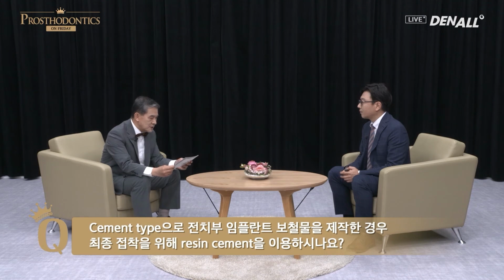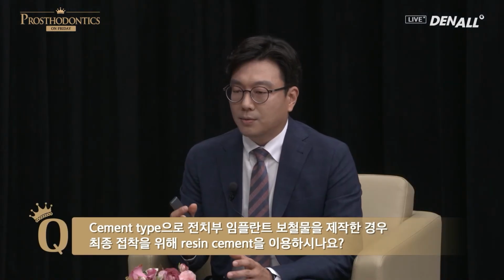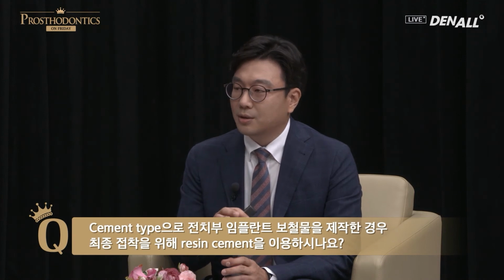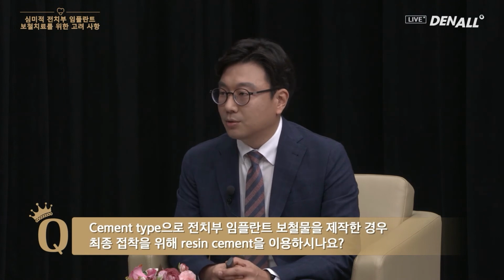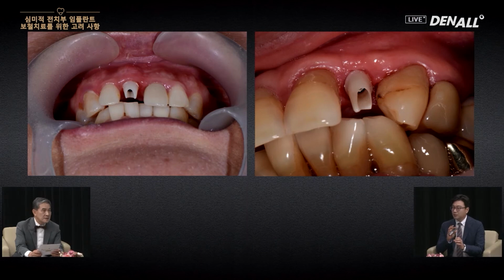Do you use the resin cement for the final cementation? In my case, for the final cementation in the anterior region, I use RMGI cement. If you use temporary cement like Tembond, they sometimes fall off, inviting a lot of complaints.